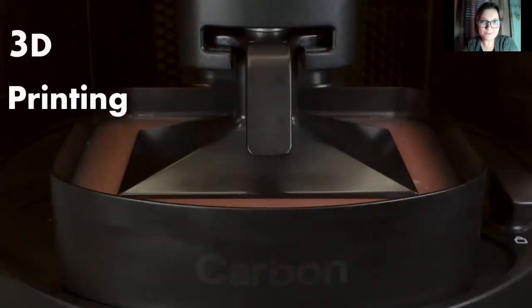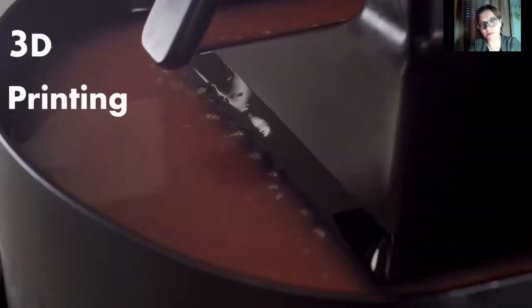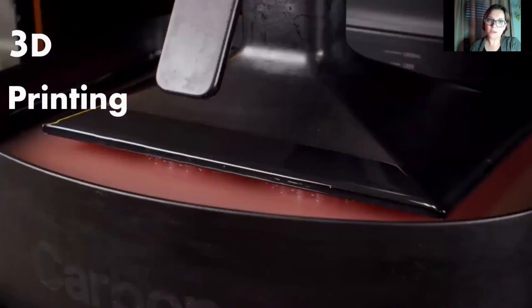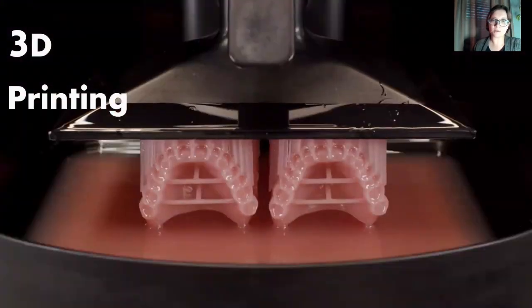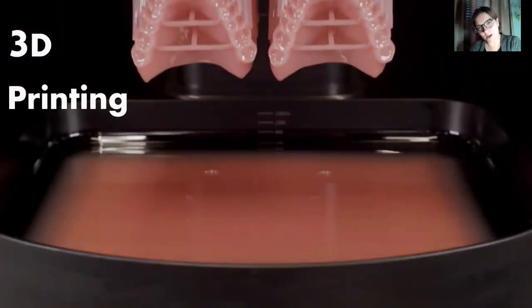So after milling, we have 3D printing. This is the additive manufacturing technique of making dentures. You have this vat of uncured resin, and it's being cured in layers by a laser light. And as it rises up, you'll start to see the layers build into a denture. Those crossbars that you see across the front are to help maintain stability during printing and post-processing, so you have more accuracy of fit as well.